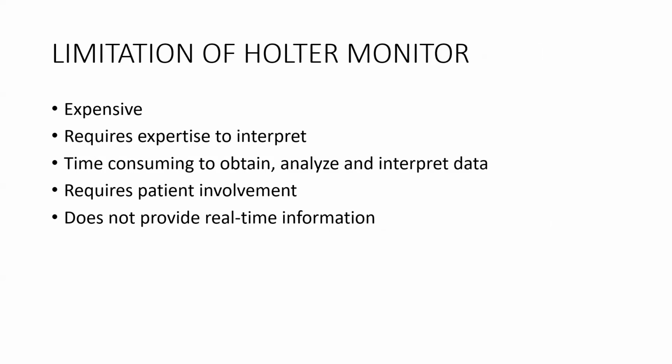It also requires patient involvement in that the patient will need to consciously avoid those things, keep to the restriction, write down the symptoms, the activities, and also activate the event button. So it requires patient involvement. And most importantly, it does not provide real-time information. So the whole process would have to be completed.